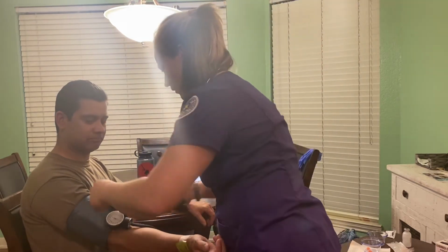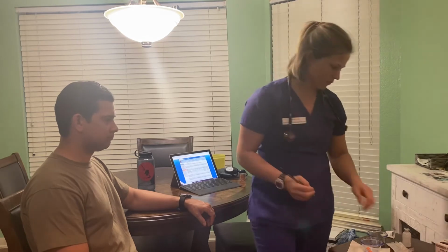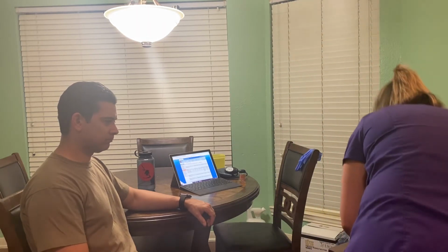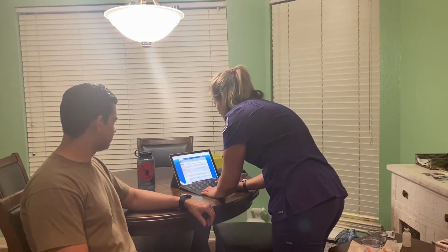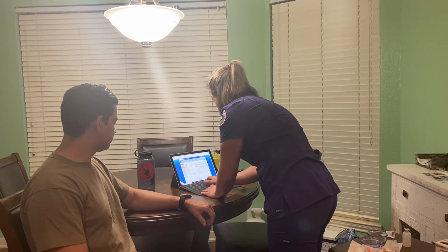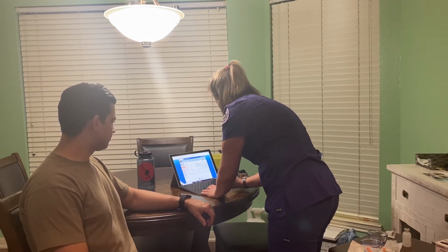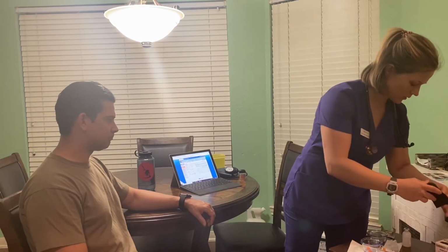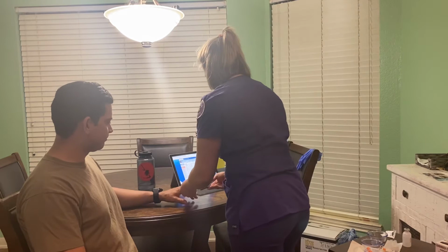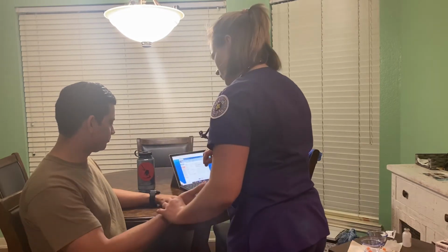I have 130/88. Let me check your O2 stats real quick. And go ahead and check your pulse and respiration.